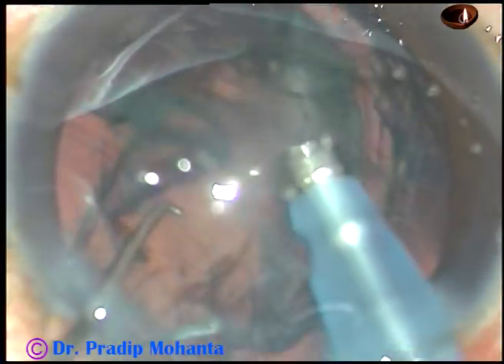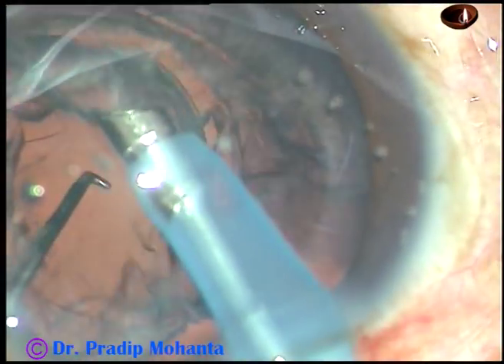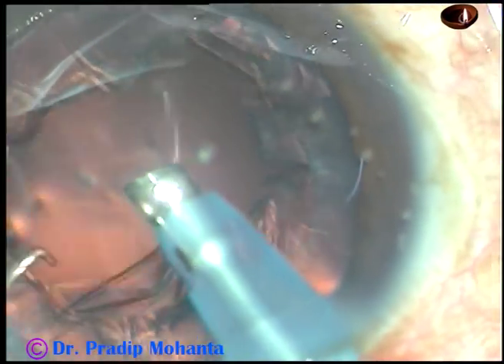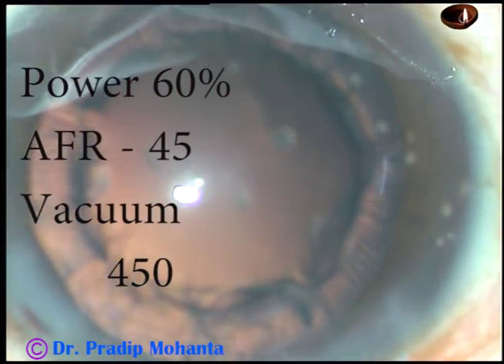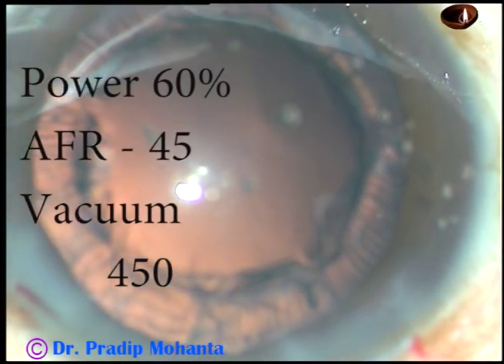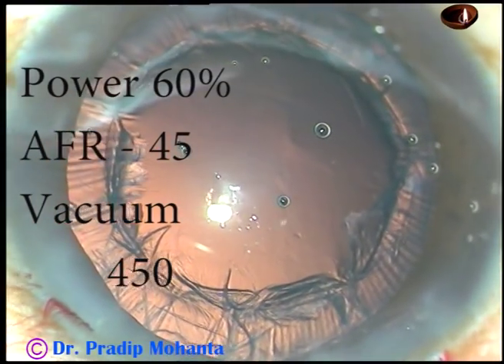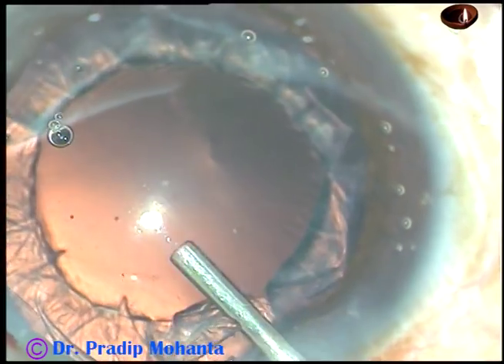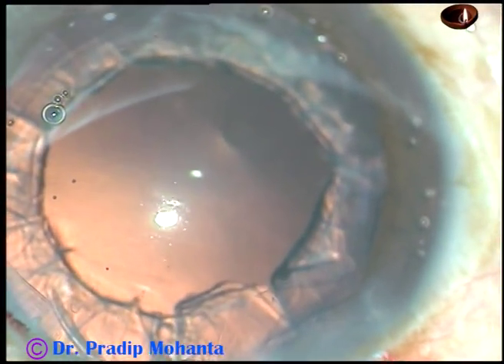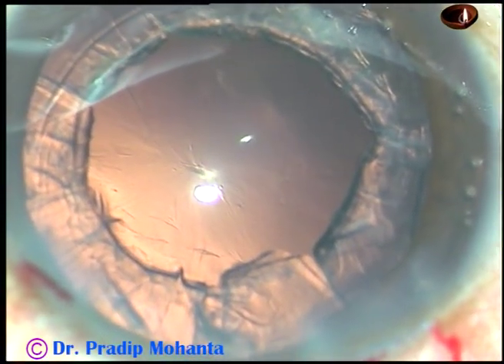So if you do direct chop, it saves not only ultrasonic energy, it saves a lot of time. And it becomes great fun if you can complete this surgery safely within a short time.